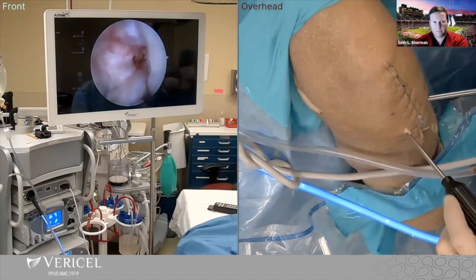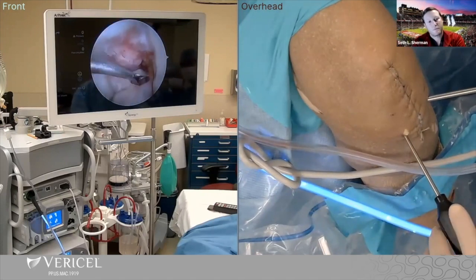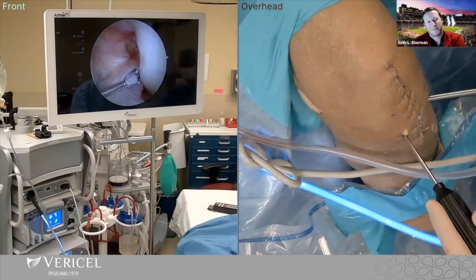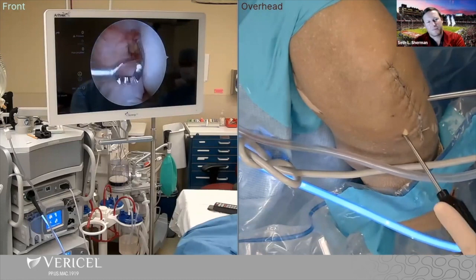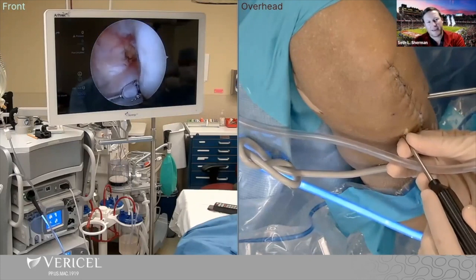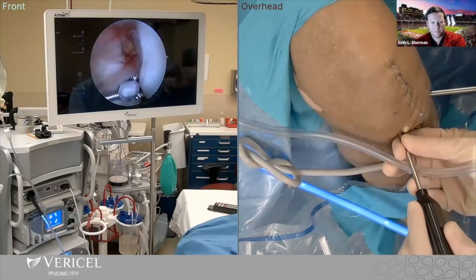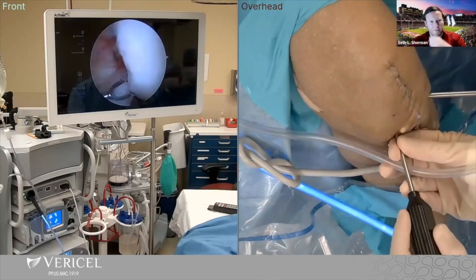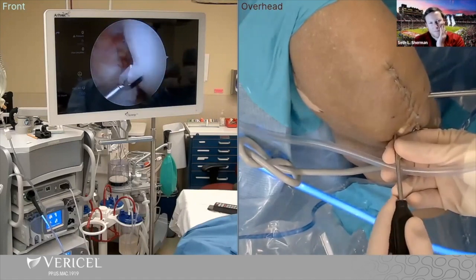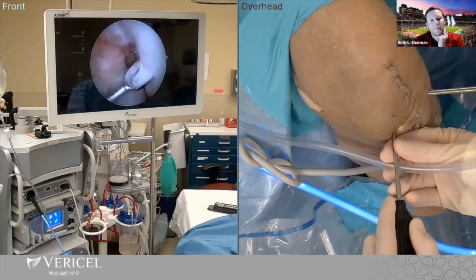I use this small curette — a little minuscule curette I use for other procedures as well. I always start going up then going down, because if you do it the other way you'll skive, especially with the angle. Is that a two-sided curette or a one-sided? One-sided. The trick is it seems like it'll be easy, but sometimes you can skive off, so you've got to be careful because it's really sharp. You're just slowly wiggling back and forth. You take off some bone sometimes too, and that's okay.